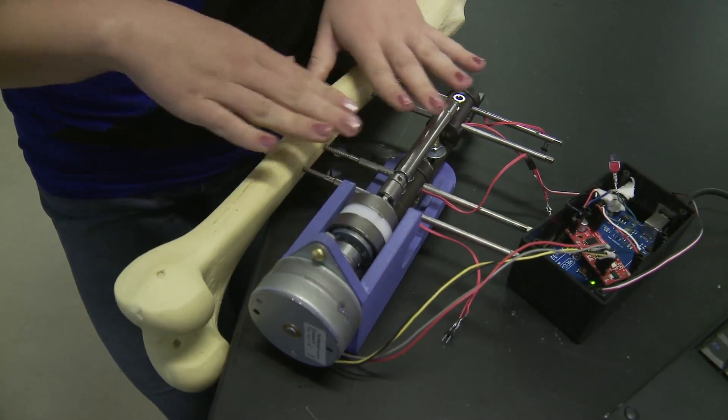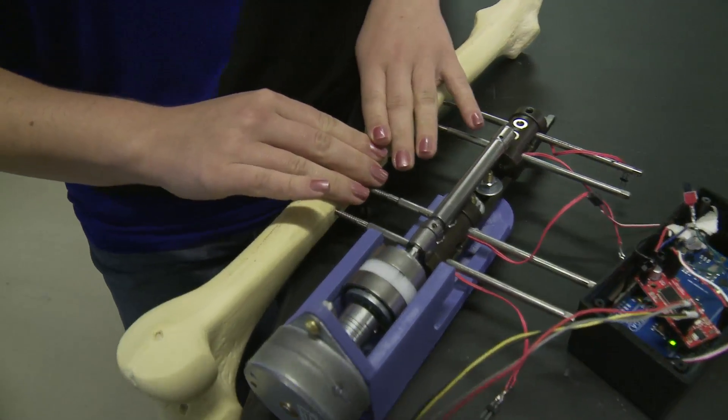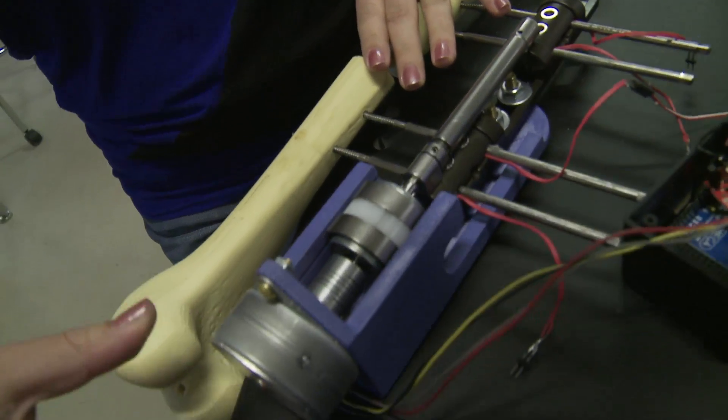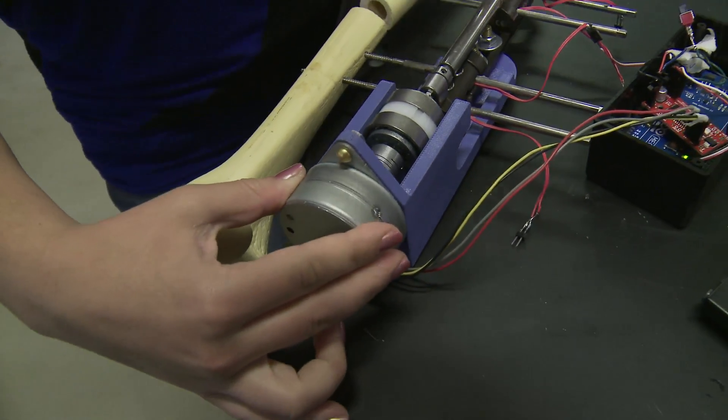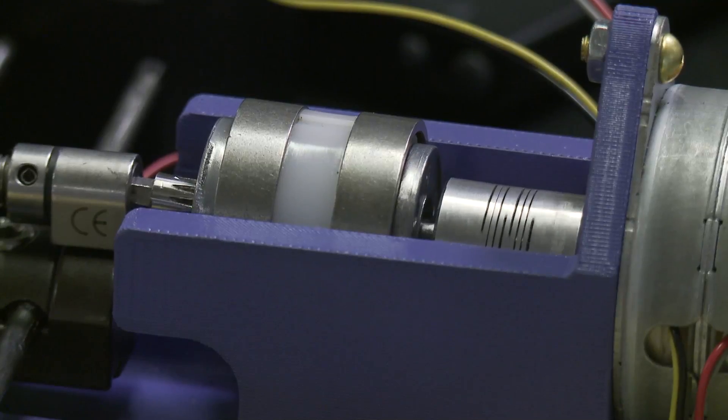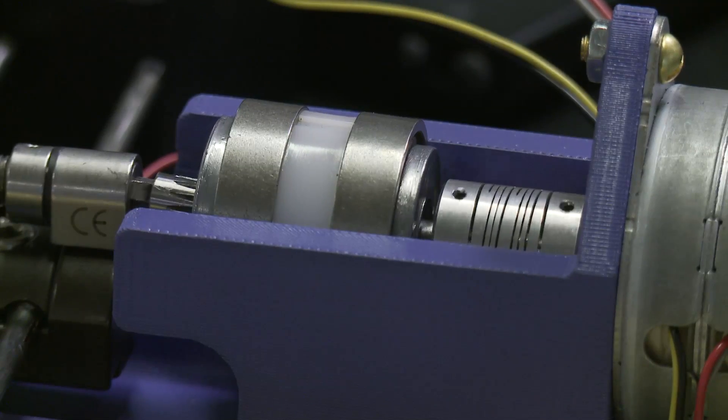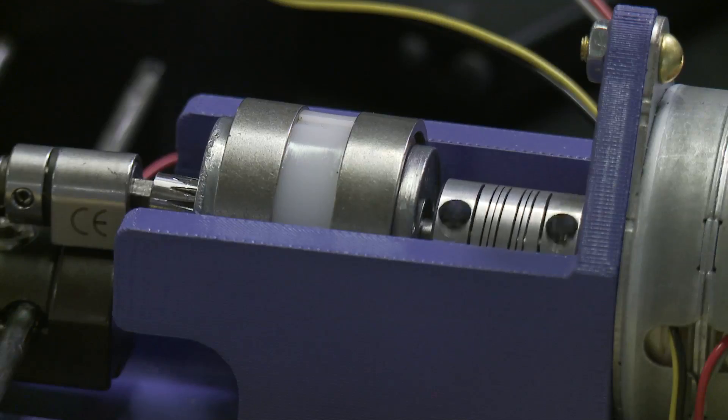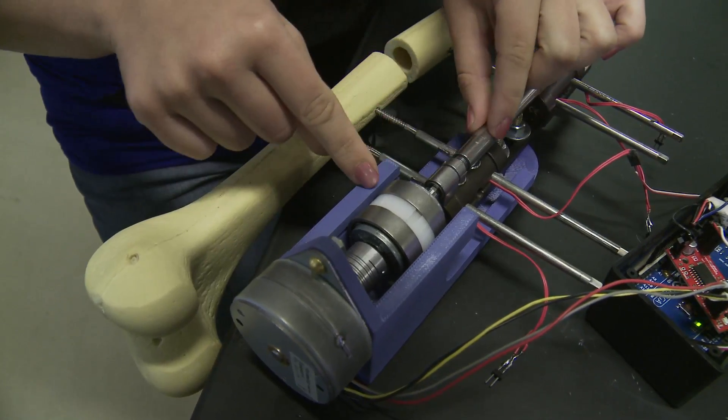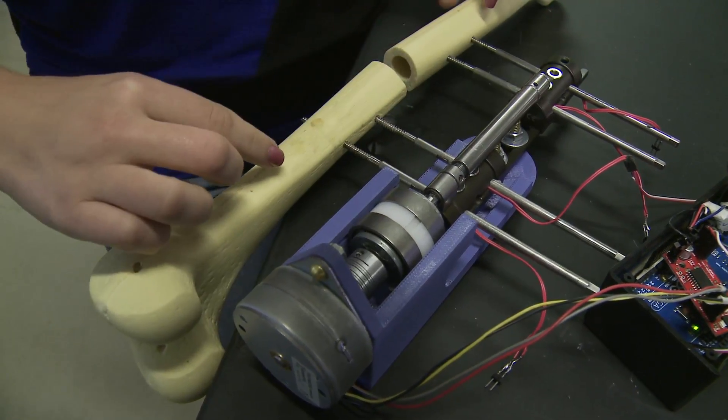So what we have here is the original device mounted on the bone and then we've added this part here. This is a motor which, when turned on, you can see now it's turning. So instead of using your hand and a wrench to open this up and stretch the bone, the motor is now doing that automatically.